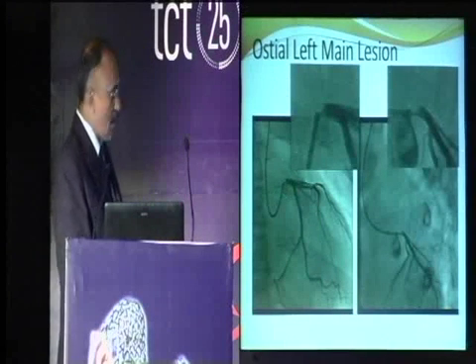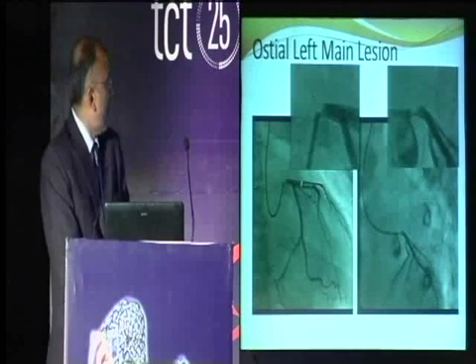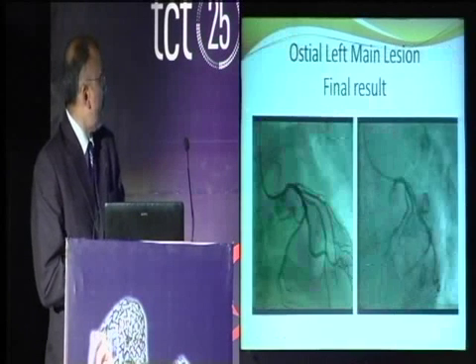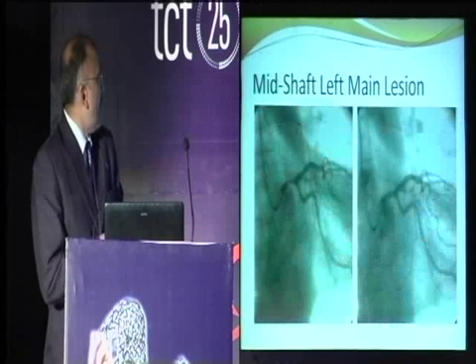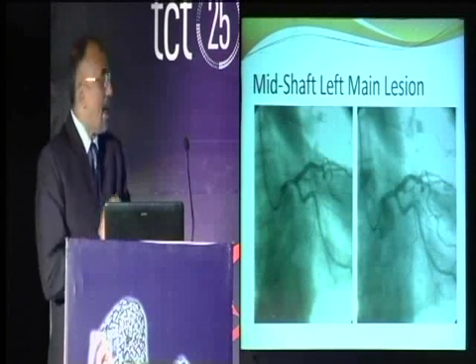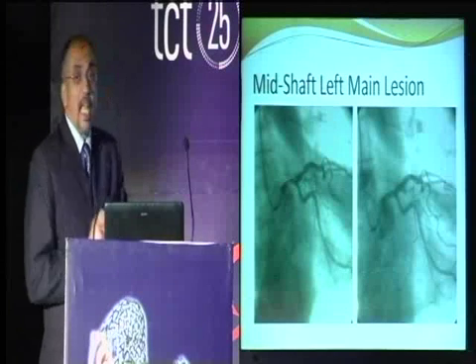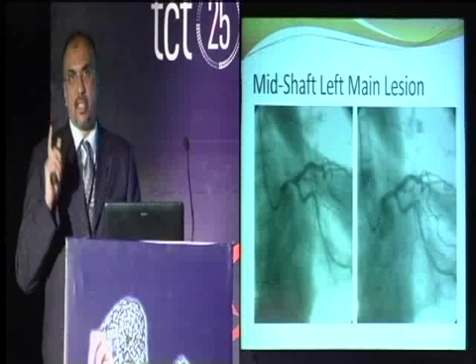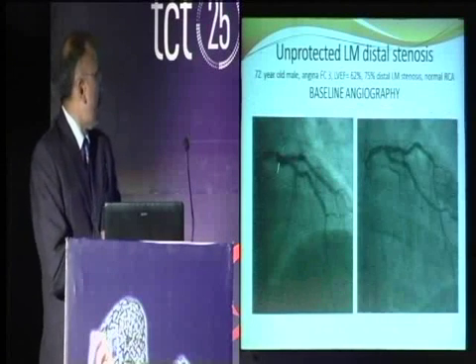So this is a left main ostium. You got a left main ostium, single stent, direct stent, balloon dilatation. You have a good result. This is a shaft. Shaft angioplasty. Again, it is fairly straightforward if you choose the length and diameter of the stent well.